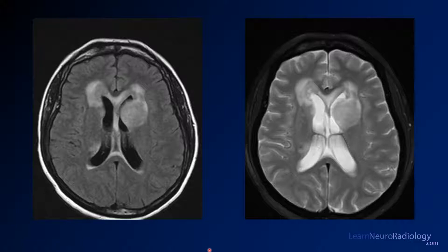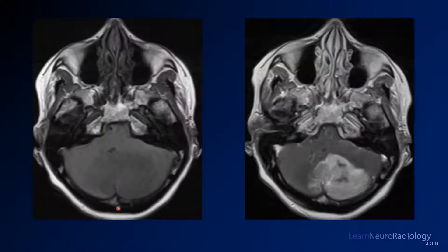Coming up a little bit higher, you'll see additional masses — another mass in the left anterior basal ganglia caudate, probably another mass along the margin of the lateral ventricle, and something in the right thalamus as well. On pre and post contrast, at the level of the cerebellum you see a hypointense area which enhances very avidly on post-contrast imaging — very solid enhancement.